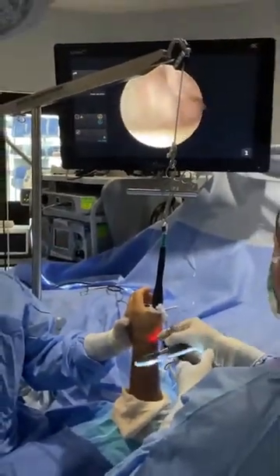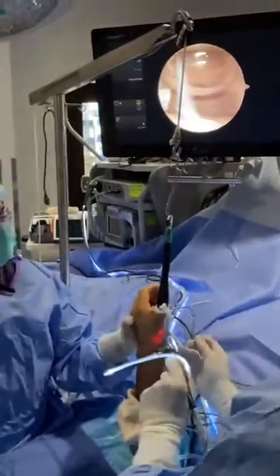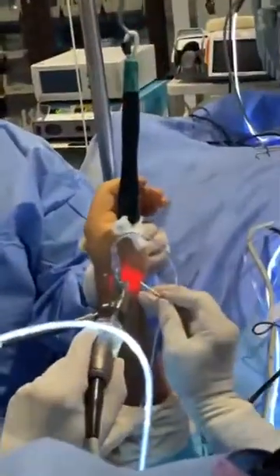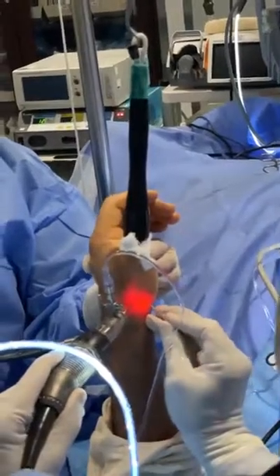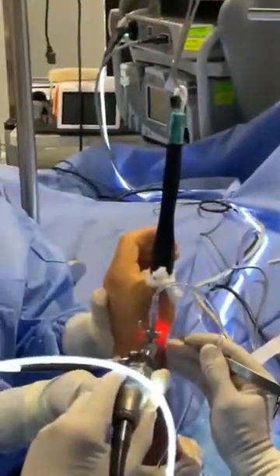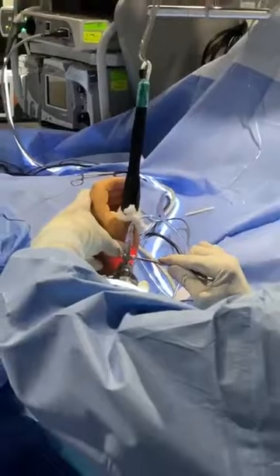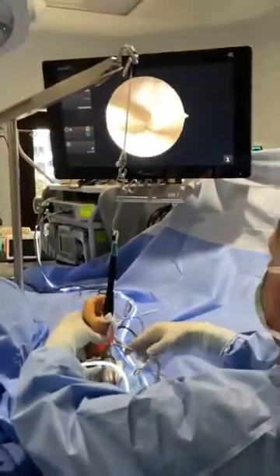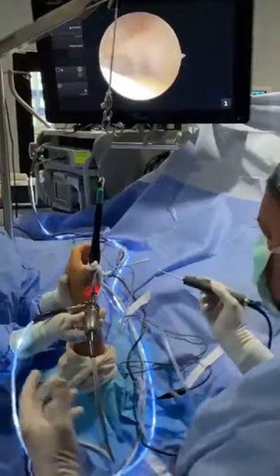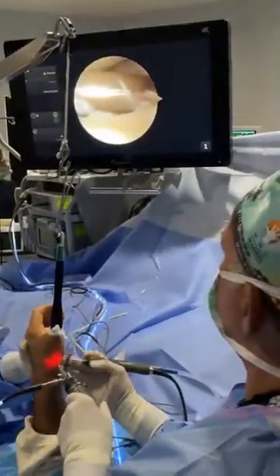Two little holes — we're going to resolve this guy's problem. Let's get an 18-gauge needle. Now we're going to create another portal, going a little bit more distal. This is almost a thenar portal which was described by my colleague Aurelata about 15 years ago. A lot of what I'm doing here is not totally new, but it is still a technology that's really underutilized for reasons that are unclear to me.